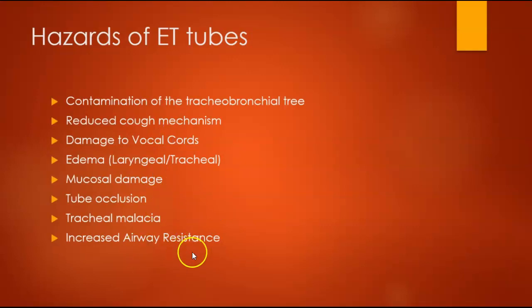So another common thing with ET tubes, we talked about this in infection control, is biofilm. Next time you see somebody get extubated at your internships or the summer when you're at clinicals, take a look inside that tube. It's going to be gross. There's going to be crusty mucus secretions built up on the inside wall of that ET tube, and that's considered biofilm, and that starts happening pretty much right away when a patient's intubated. And that can really restrict the flow of gas through their airways too.